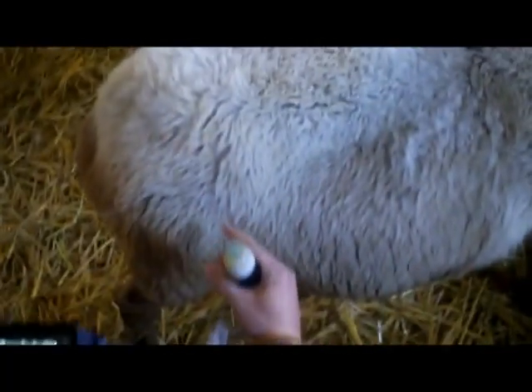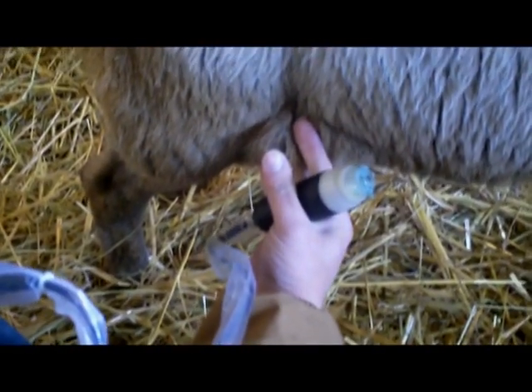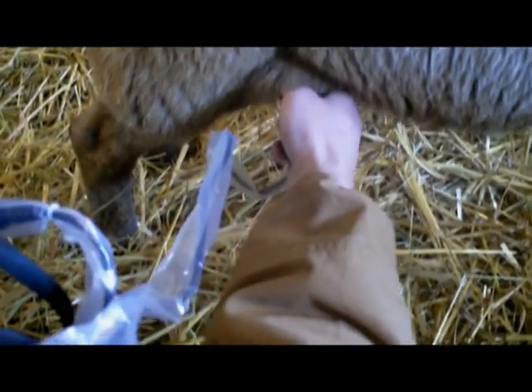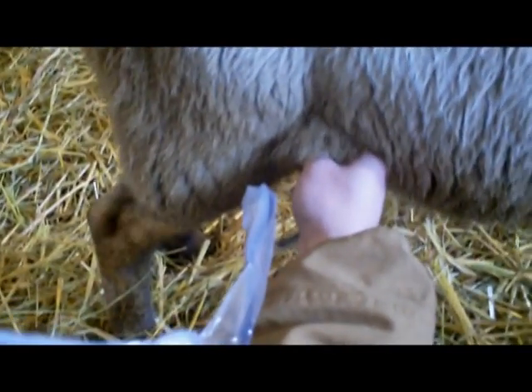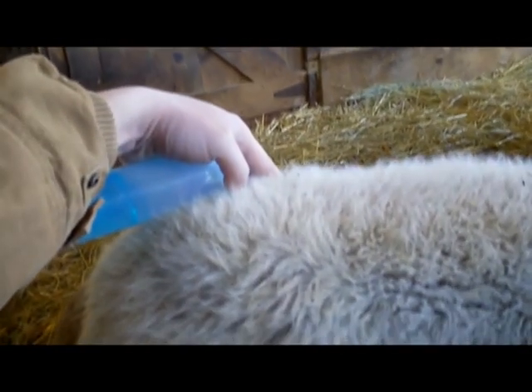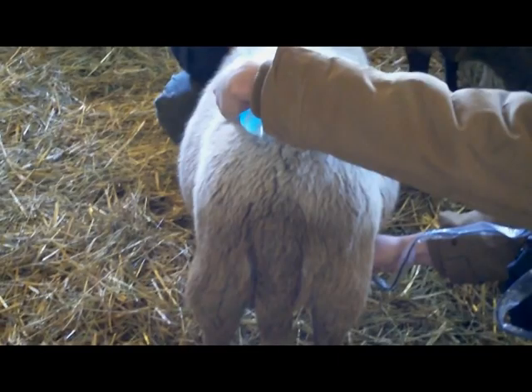The probe should be placed right in the pocket of the right flank as shown here, and aimed towards the left hip. Here is a view from the back.